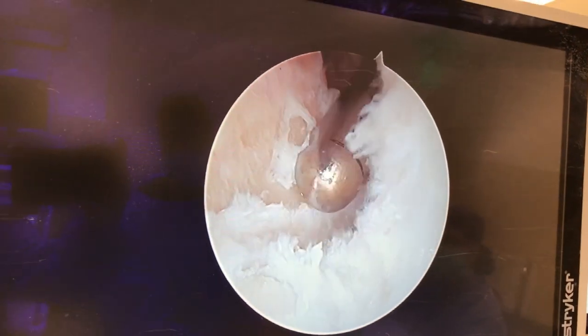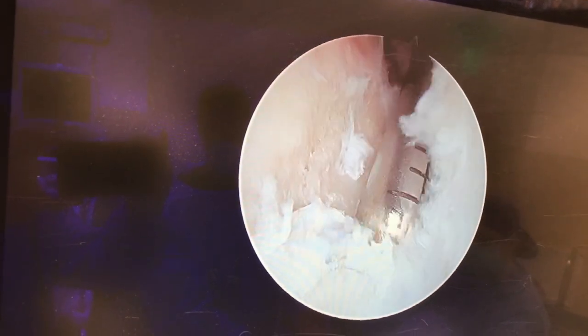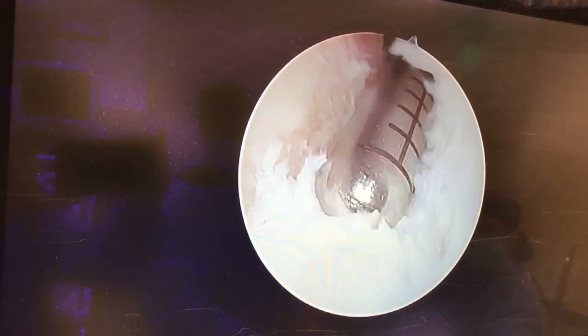What we're doing is simply trimming it out like a cuticle. You trim it, you won't tear off more cartilage, and these patients just end up feeling a lot better.